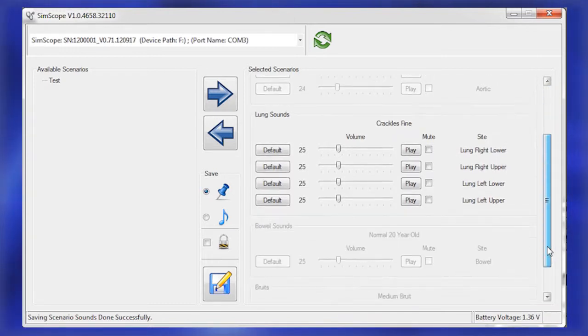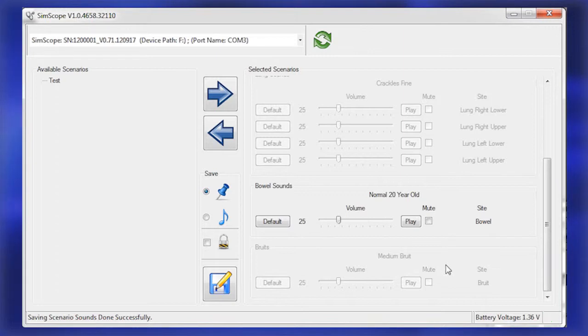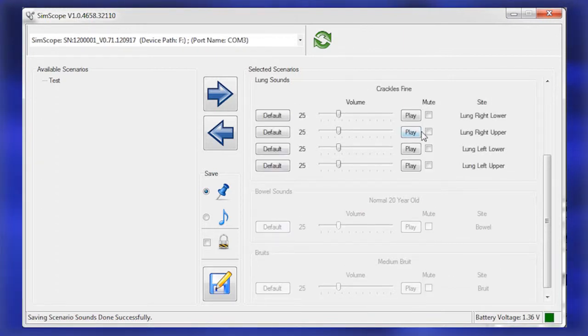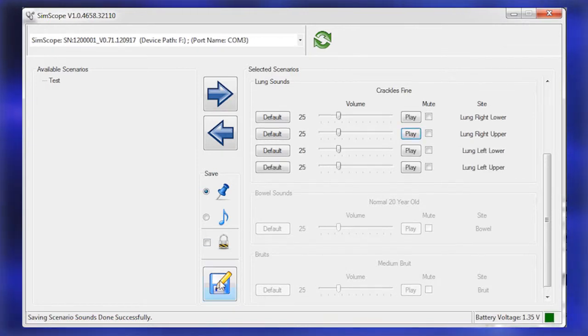Repeat the process for other sound groups. Save the new scenarios and volume defaults to the SimScope by clicking the disk icon.